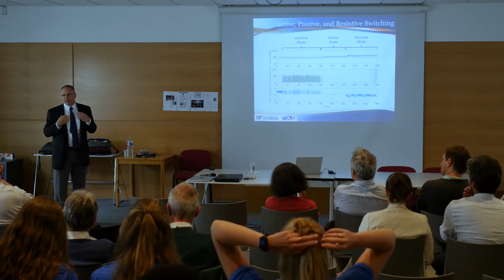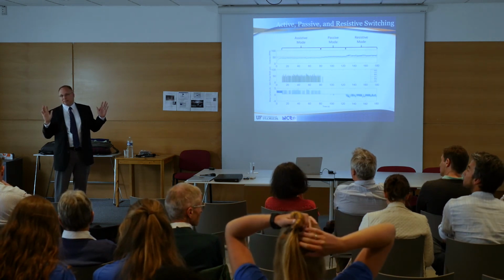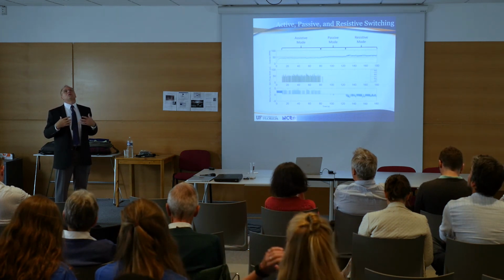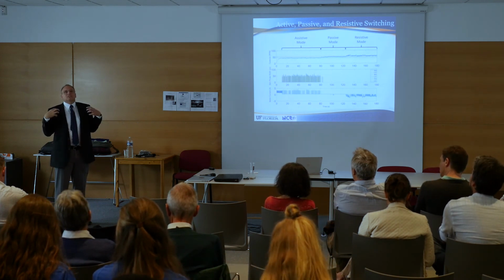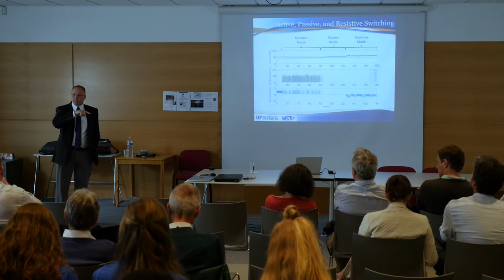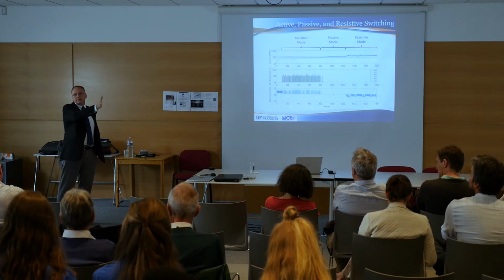I was the first guinea pig there. This was some of Matt's work. Matt brought me in over a weekend, and I had to stop the experiment because I was able to maintain desired output, but the sensation of fatigue was so overwhelming, I just couldn't stand it. It wasn't the intensity of the stimulation. It was a level of fatigue that I've never felt before in my life. Yet, by switching the frequencies and intensities in a similar way to what you're describing, we were able to maintain performance in terms of meeting a target the entire experiment.